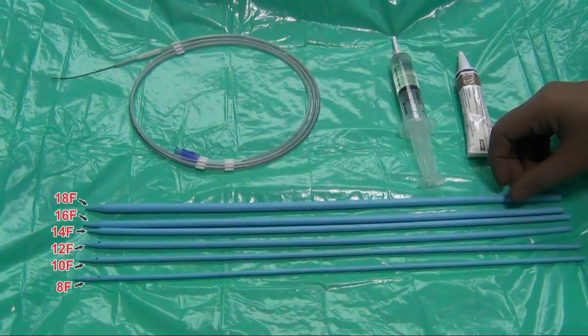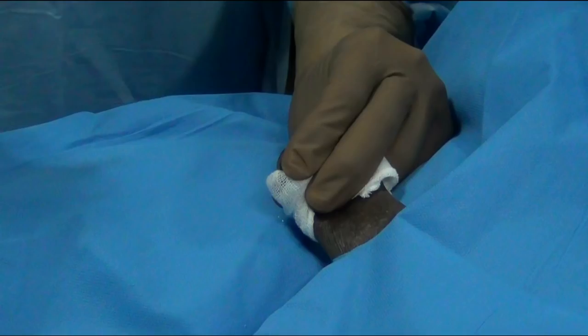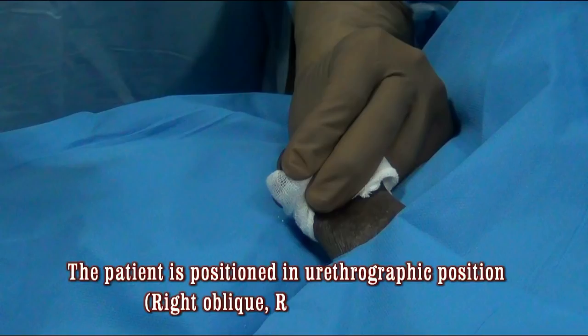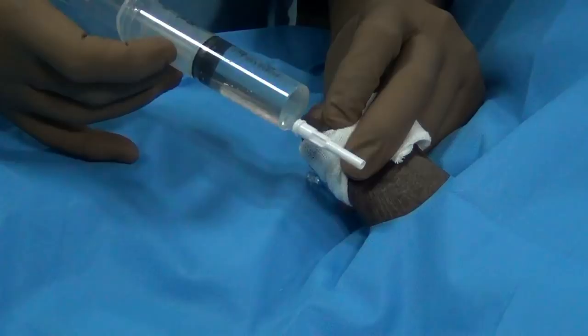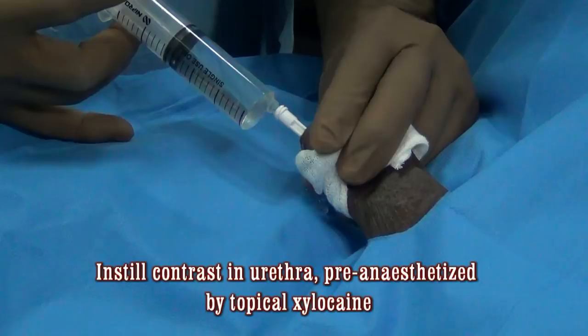The patient is positioned in the operation theater under the C-arm in the right oblique position with the thigh flexed, which is the same position used for doing a retrograde urethrogram. The meatus is first lubricated with gel, and then you instill about 8 to 10 ml of radiographic contrast to opacify the urethra and see the stricture under fluoroscopy.